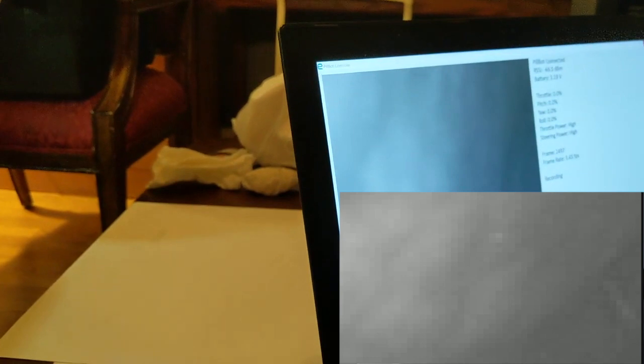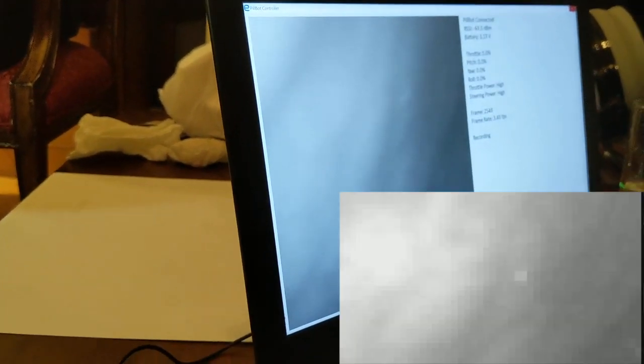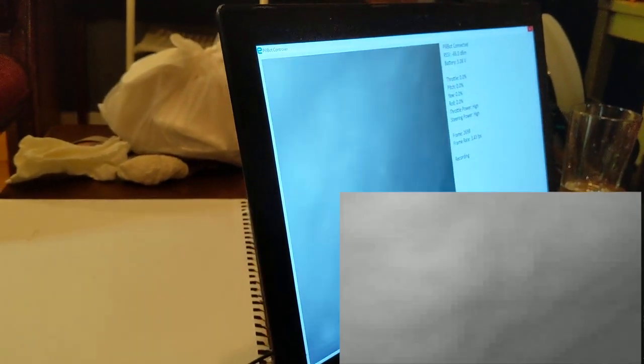You can see like some of that structure over there. I'm going to try to go look at that thing. So I'm going to inch forward, just a tiny bit. Now you can see like all these things that are floating on the surface. What have you been eating? It'd be hilarious if I'm just like riddled with tapeworms or something. We're going to have to send this to Ben. A little bit to the right. I'm going to bump into it and see what those things are. What are those floaty things? In the kind of one o'clock area there's a white dot. You're getting real close to it now. Just floating around. I'm inching up into these things. I think I'm going to call them danglia. Danglia? Yeah, because they're dangling.